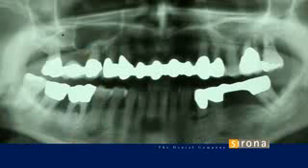The patient had already expressed a wish for her own teeth to be preserved as long as possible. For this reason, we will be carrying out a closed periodontitis treatment aimed at a maximum reduction of bacteria. This treatment will be performed using perioscan.